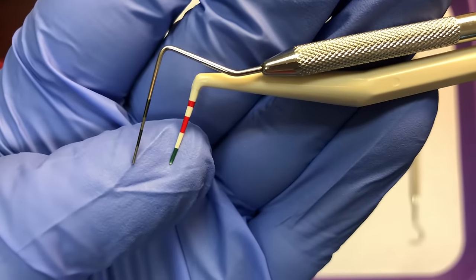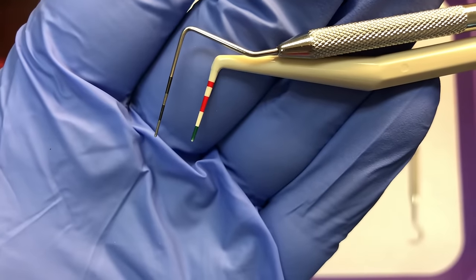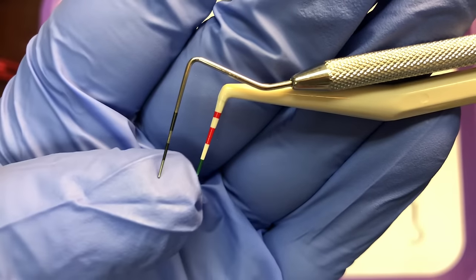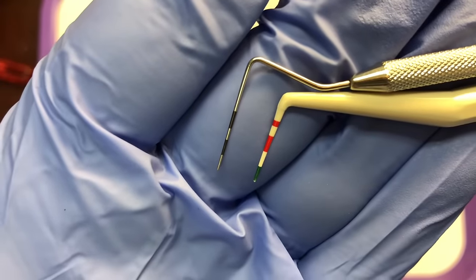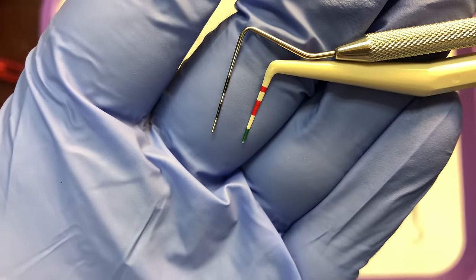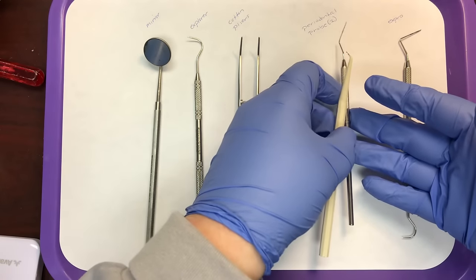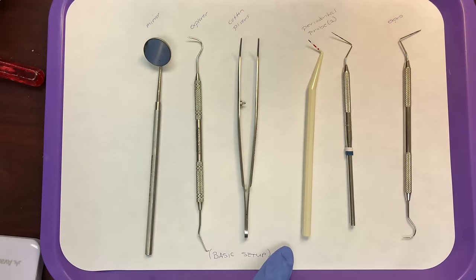It's operator preference whether to use metal versus plastic. The probes can be color-coded — green indicates the sulcus is at a healthy level, red indicates unhealthy, and the white transition area indicates a borderline number. Periodontal probes are used to measure sulcus depth, and healthy sulcus depths are three millimeters or less.